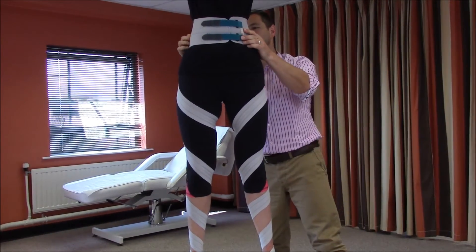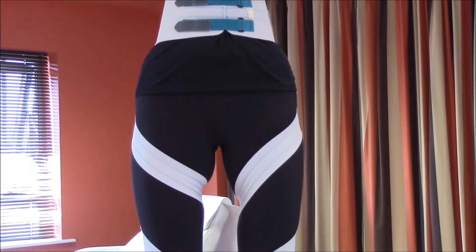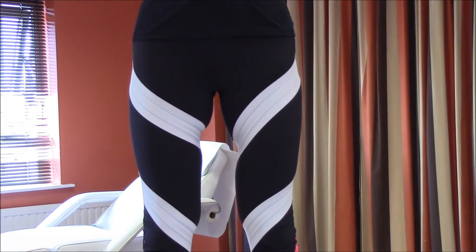Once more, check the fit and that the user is comfortable. If so, reassess the gait and determine whether internal rotation has been reduced.